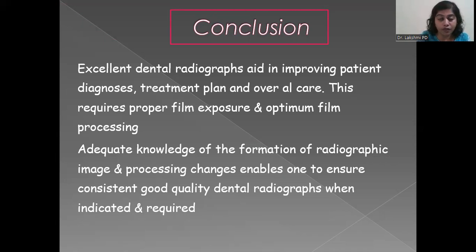And for a dentist to have a good radiographic image, ideal knowledge about the entire film latent image formation and the ideal processing procedures are essential to create consistent good quality radiographs, so that it can always aid in your diagnosis and your treatment plan and not just give you the amount of information which is already gotten from your clinical observation. So hopefully this class has been explained in a very simple way, and this should always be in your mind when you go to your dark room: what actually happens when you dip your film into a developer solution, when you rinse it, why is there a need for rinsing, that too for 30 seconds, and why do you need to wash your film adequately after fixing?